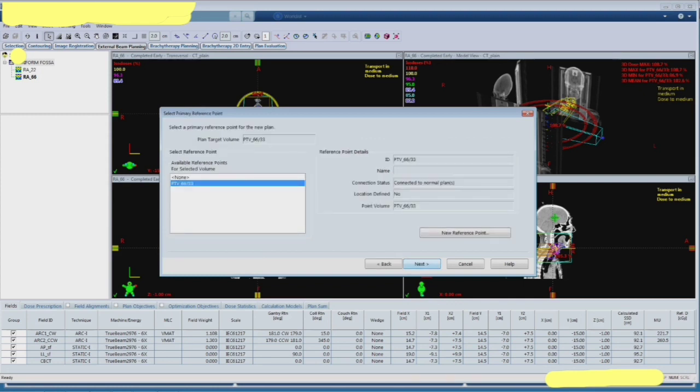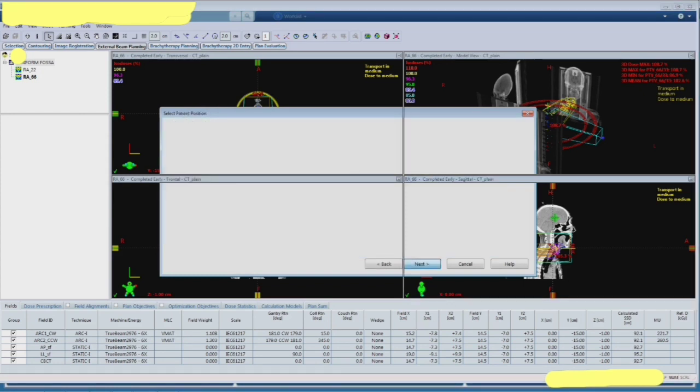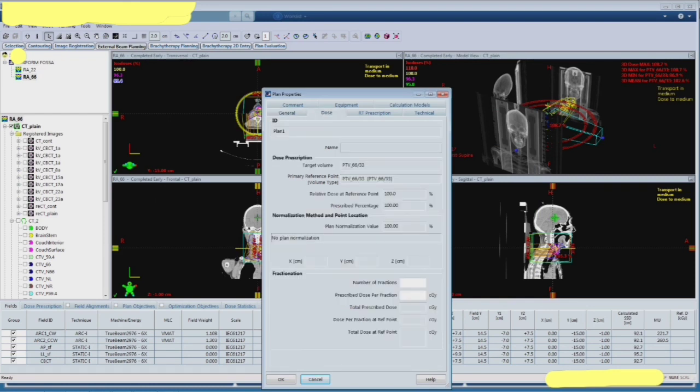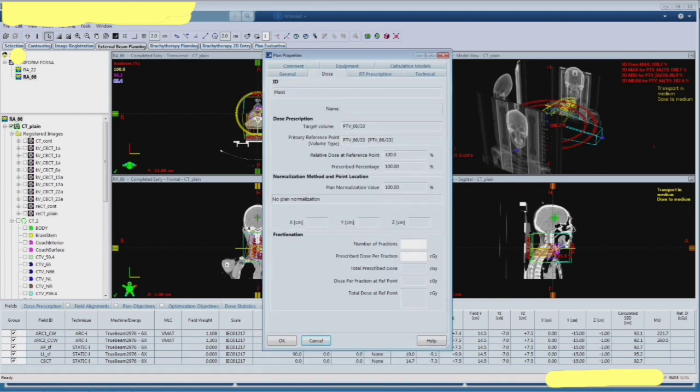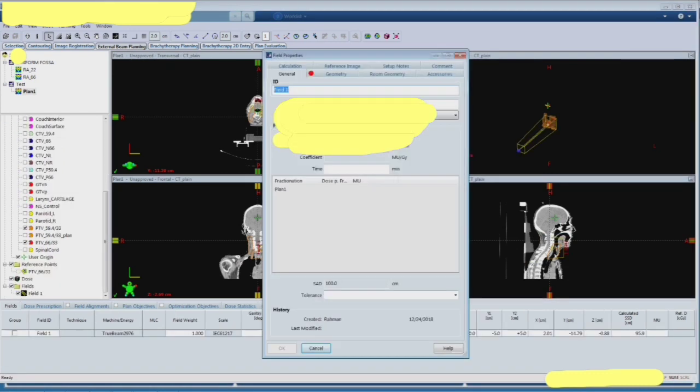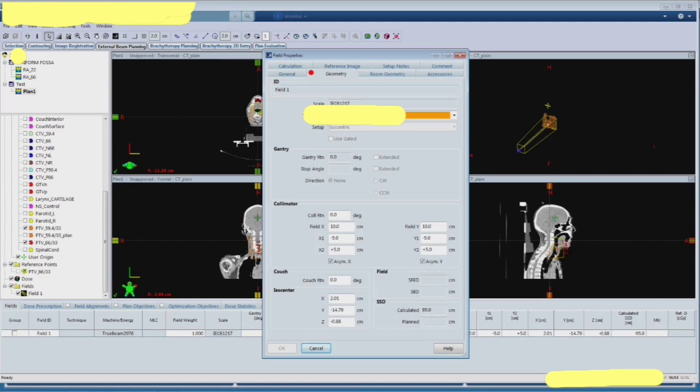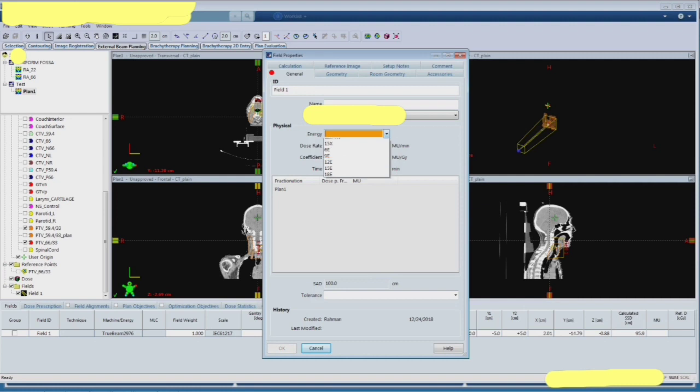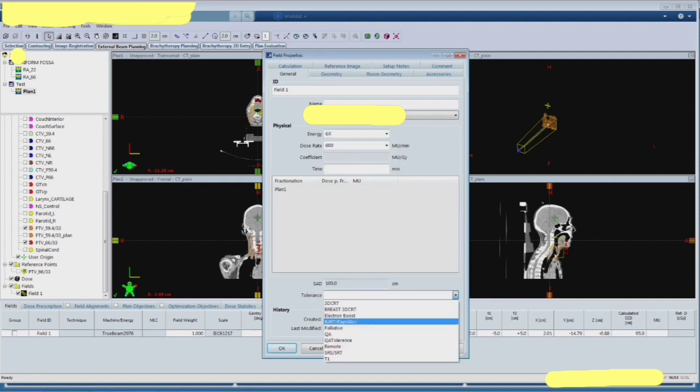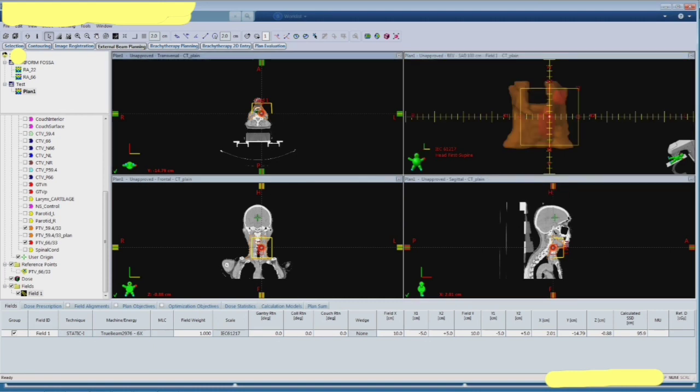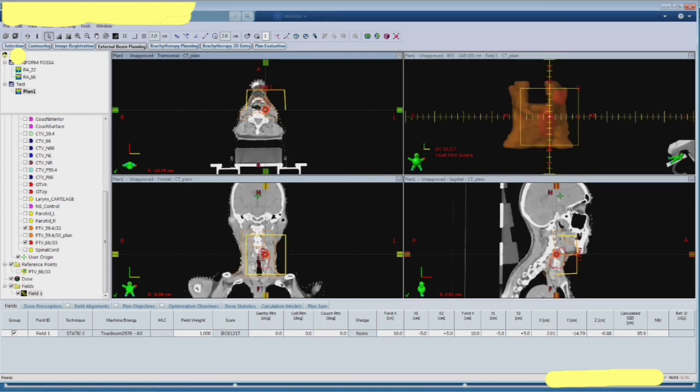You need to choose the target volume and priorly you have to give the prescription dose and number of fractions, and then you have to choose the machine. Then you have to go to the geometry, choose the static mode, and then choose the energy and then choose the tolerance table.